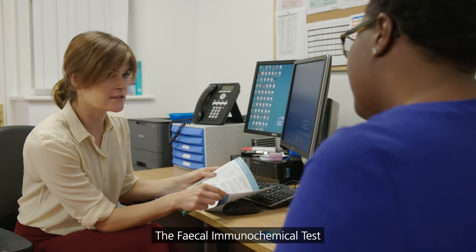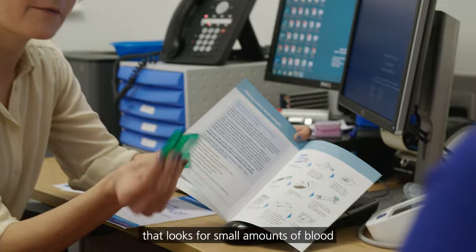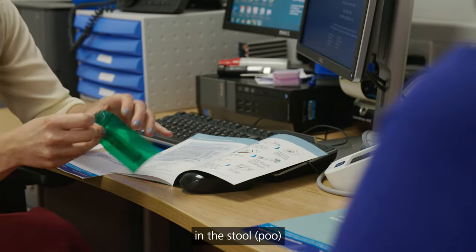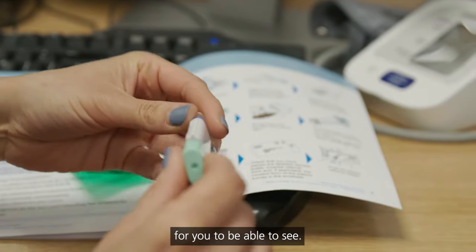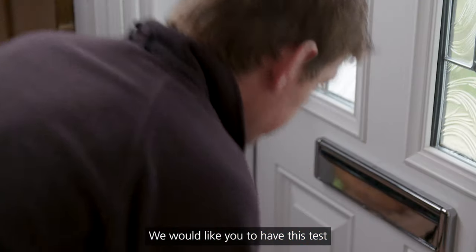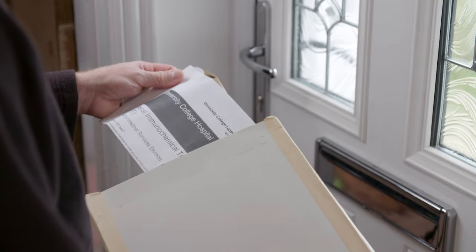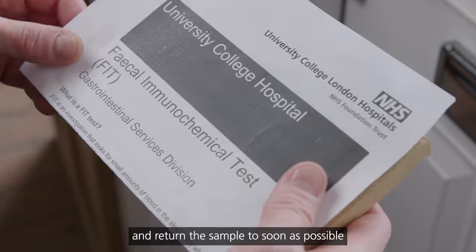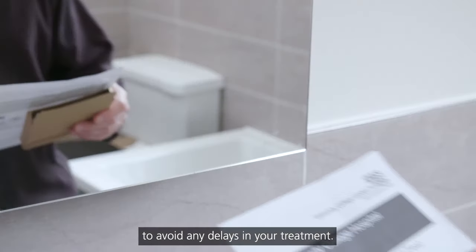The Fecal Immunochemical Test, or FIT, is an investigation that looks for small amounts of blood in the stool or poo, when the amount of blood is too small for you to be able to see. We would like you to have this test as part of the investigation of your symptoms. You should complete the test and return the sample as soon as possible to avoid any delays in your treatment.